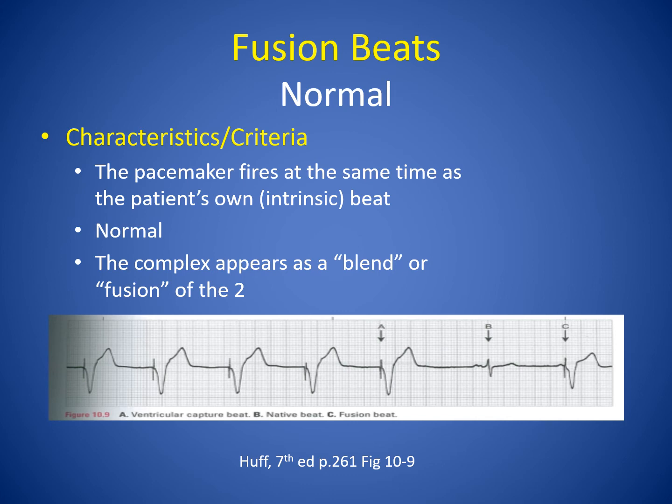When we talk about fusion beats, these are normal. What that means is that, again, the pacemaker is on demand. They are not as common as the number of examples you'll see in the book would lead you to believe. We will basically see the pacemaker fire at the same time the patient's own intrinsic beat occurs. It's almost like the pacer is ready to fire and the patient's own beat came in at the exact same time. This is normal.